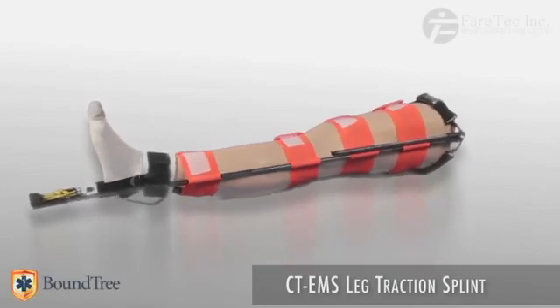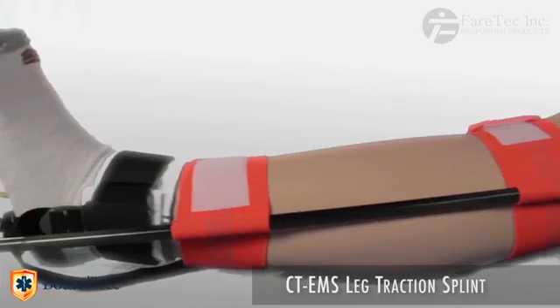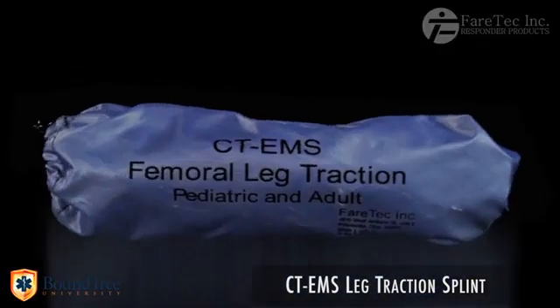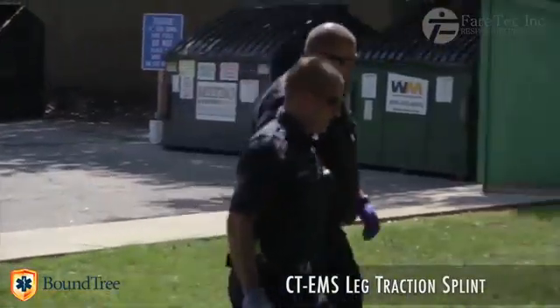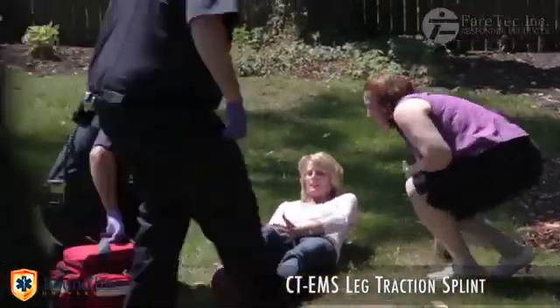Introducing the CT-EMS Carbon Traction Leg Splint, a splint to solve your leg traction needs in a small one-pound bag. The CT-EMS Carbon Traction Leg Splint has been designed to stabilize all sized patients with femur fractures.